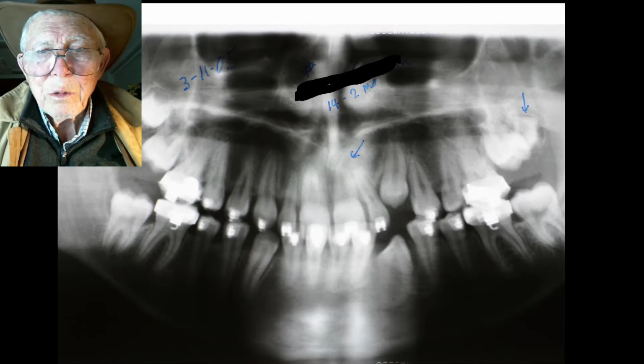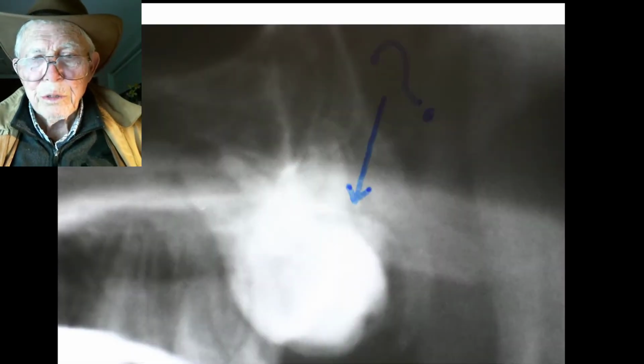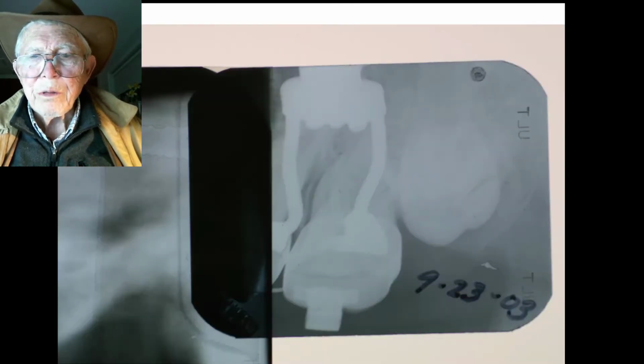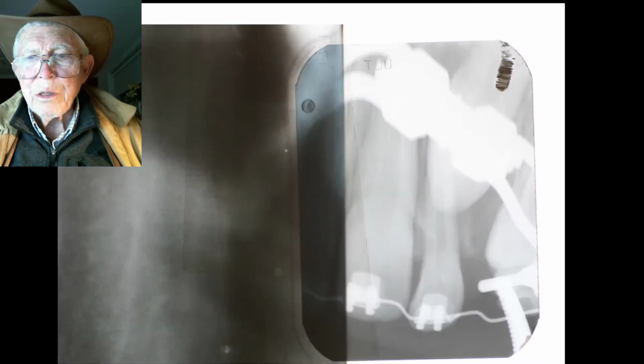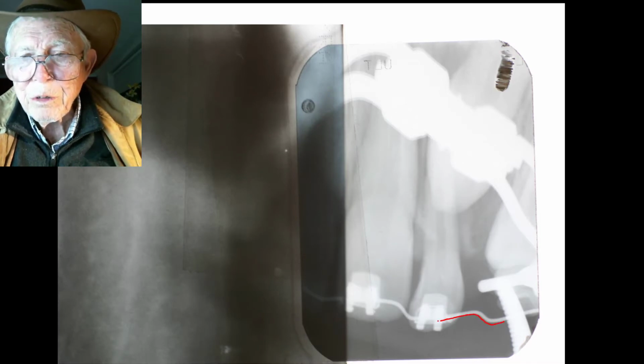We have to close some spacing in between here. I don't show this to the end, but there was something back here. This is a wisdom tooth coming in. That doesn't have anything to do with this, but here was a good picture of the tip that we put in that tooth.